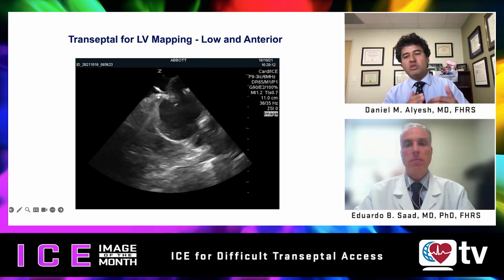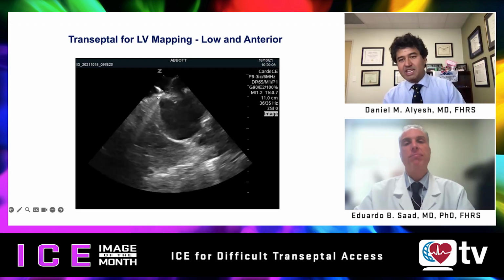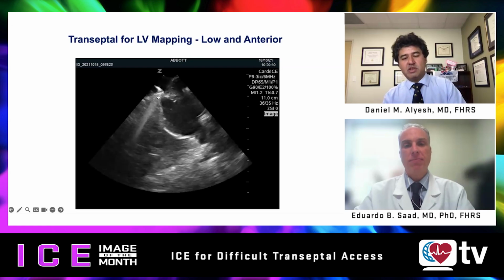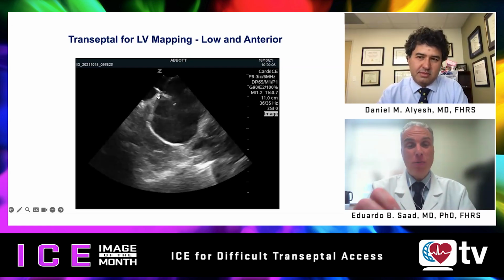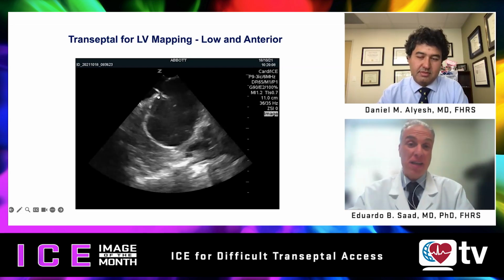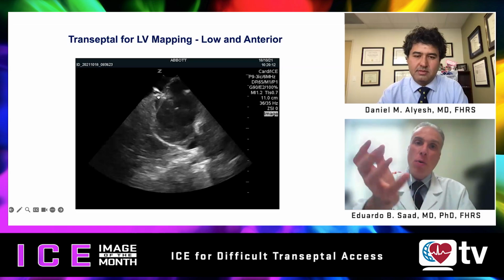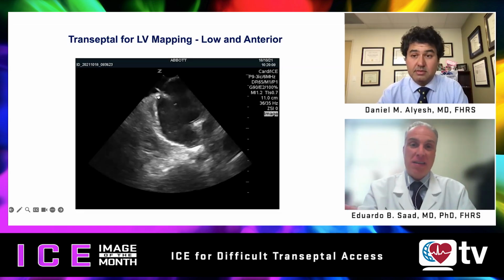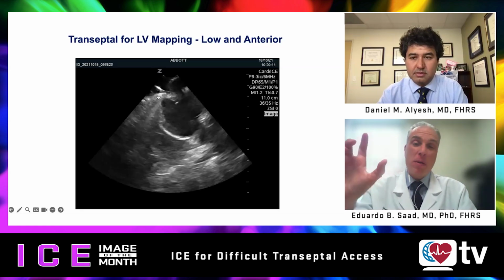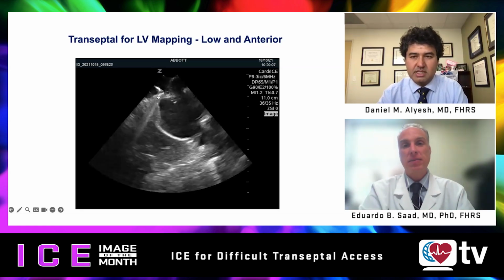And the more you can create distance with your transseptal puncture, like in this example, the more it will allow for that manipulation. If you spend time doing it, you mean saving time later on when you have to access especially that septal and inferior border or the right inferior pulmonary vein. Exactly as you said, it will be much easier to rotate and actually engage that space. Exactly.